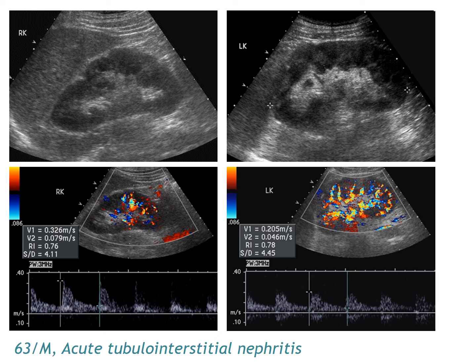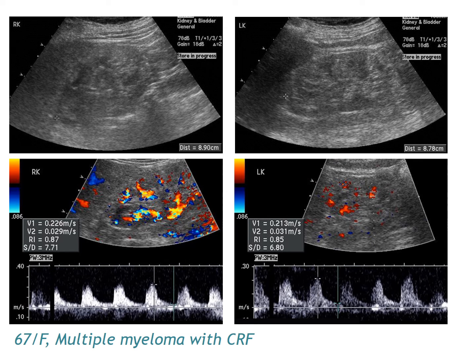Here are other cases of renal parenchymal diseases showing abnormal Doppler spectral findings. A 63-year-old man with acute tubular interstitial nephritis has swollen kidneys with relatively preserved renal parenchymal echo; Doppler ultrasound shows slightly decreased diastolic flow with resistive index of 0.76 and 0.78. A 67-year-old woman with multiple myeloma and chronic renal failure shows a small kidney smaller than 9 cm with markedly increased renal cortical echo; Doppler ultrasound shows markedly decreased diastolic flow with resistive index of 0.87 and 0.85.